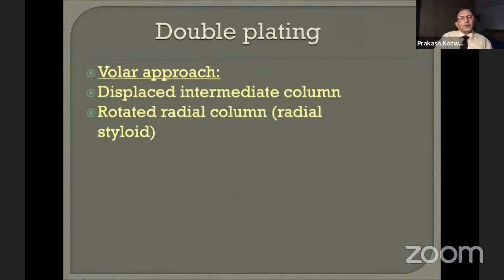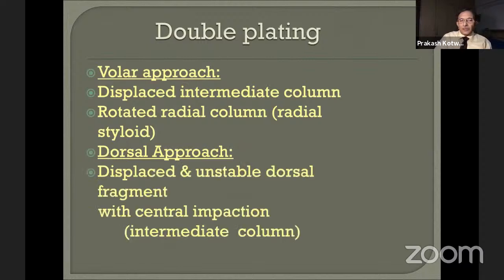The volar approach is required for displaced intermediate column fixation and the rotated radial column or radial styloid fragment fixation. The dorsal approach is required for the displaced and unstable dorsal fragment with central impaction. This is basically for the intermediate column.